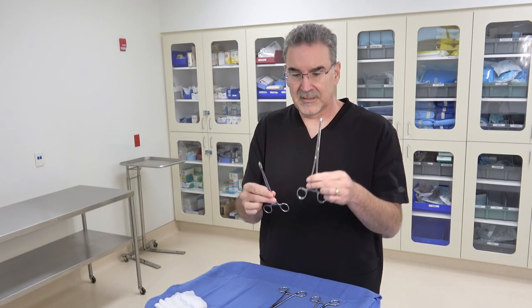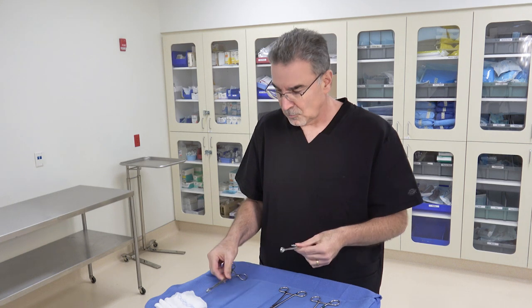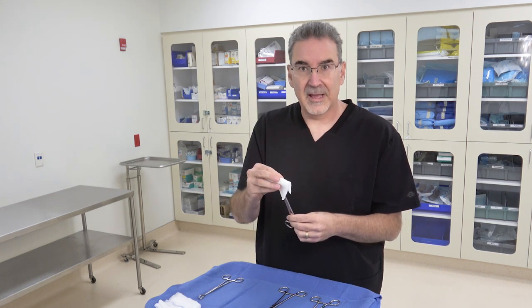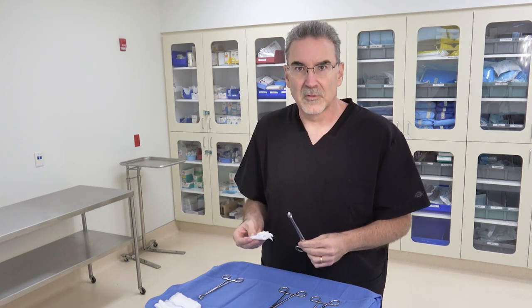We start with the Forrester sponge stick. I have two different sizes here — a smaller one and a larger one. I prefer the larger one. There are three different ways to create the sponge stick, three different ways to wrap the RayTac around the end so that it stays on securely and does what we need it to do for the surgeon.